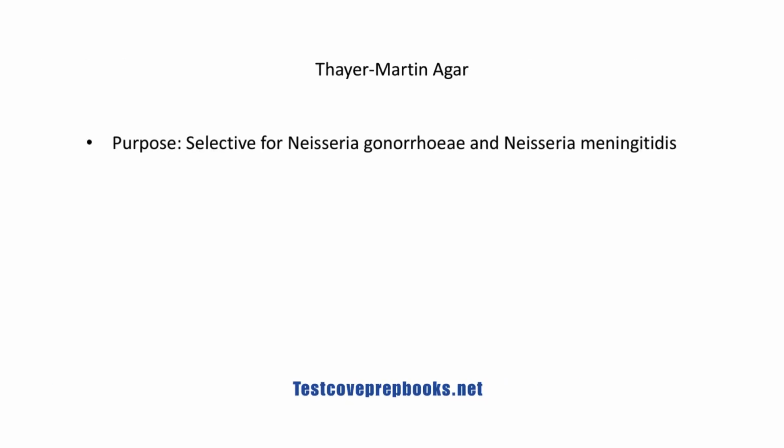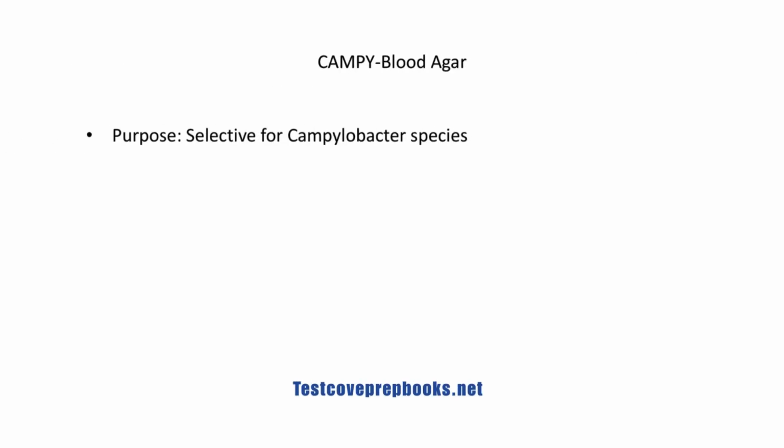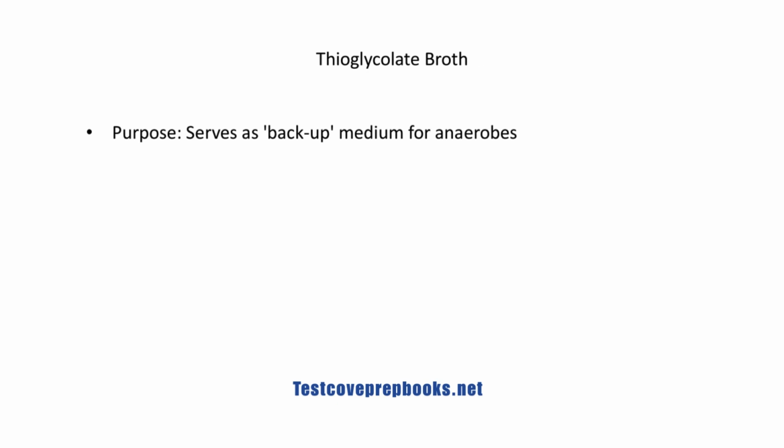Thayer-Martin agar is highly selective for Neisseria gonorrhoeae and Neisseria meningitidis. CAMPY blood agar is designed specifically to recover Campylobacter species, which require selective conditions. Thioglycolate broth is a versatile medium, often used as a backup for anaerobic organisms when primary recovery plates may fail.